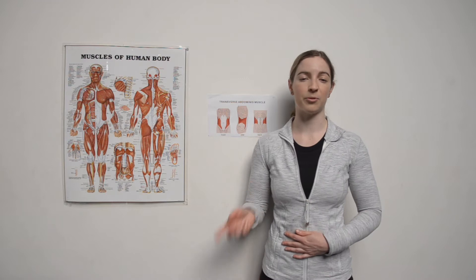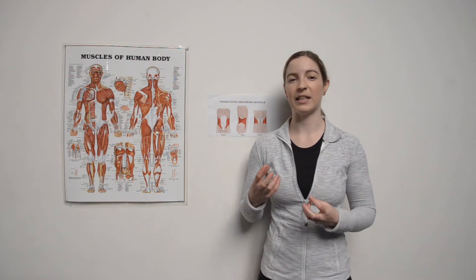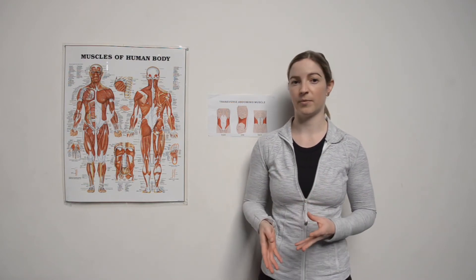Today I want to take you through real-time ultrasound of the transversus abdominis. One reason that we like to do this with our clients is it can be really difficult to actually know if we're tensing our core muscles. The real-time ultrasound, like you'll see at the end of the video, actually shows you contracting it and it gives clients a really intuitive and interactive experience of seeing their core muscles at play.